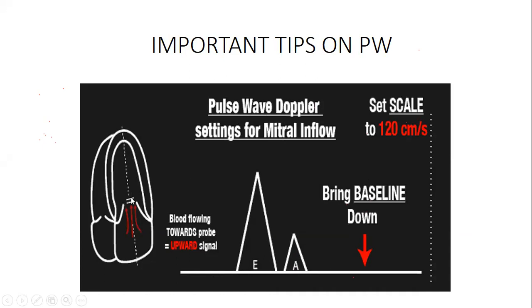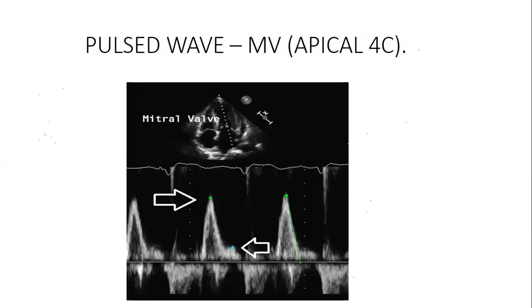Know the correct position for sampling, understand the physiology of what's going on, understand each and every part. This is the baseline, okay? The baseline simply divides the positive shift from the negative shift, okay?